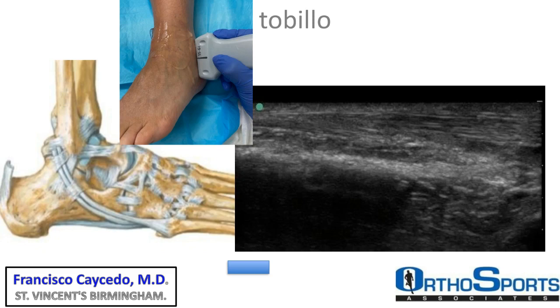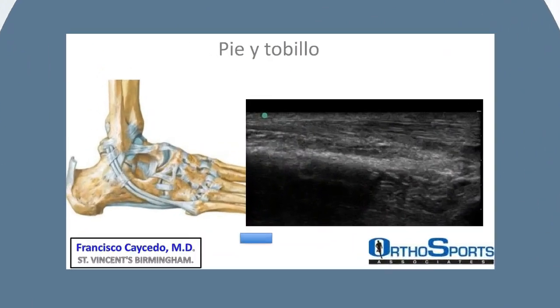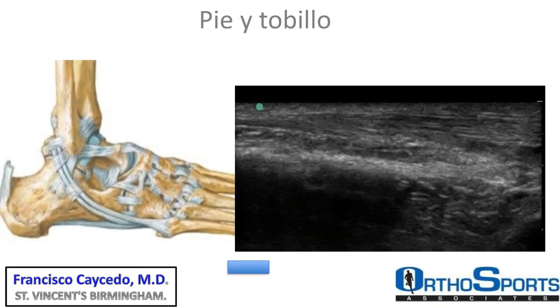And remember again, this instrument is very sensitive to inclination. So to truly call pathology, you should see the same findings with different inclinations. Sometimes you can see it in one picture, but when you change the inclination you can see the continuity very nicely. So it's also very important to do the correction through the inclination and do the correlation. In this case, you can see one of the peroneus tendons start very symmetric, then a very irregular pattern. You can see some disruption of the tendon with fluid collection. So this one represents a peroneus tendon rupture.